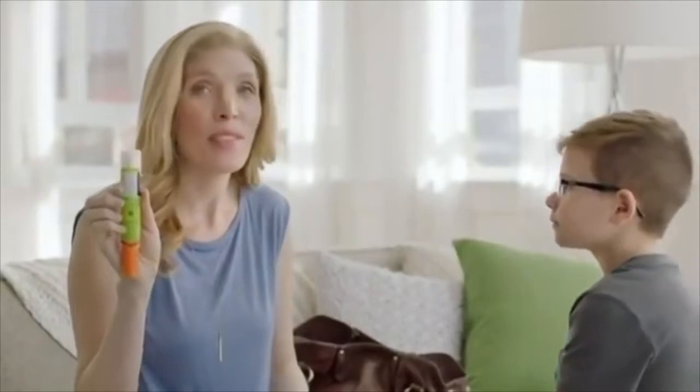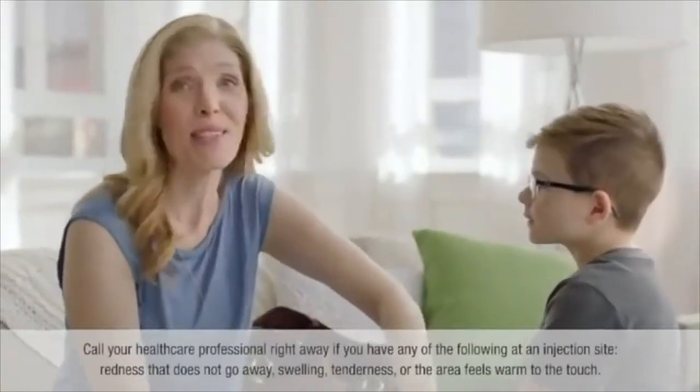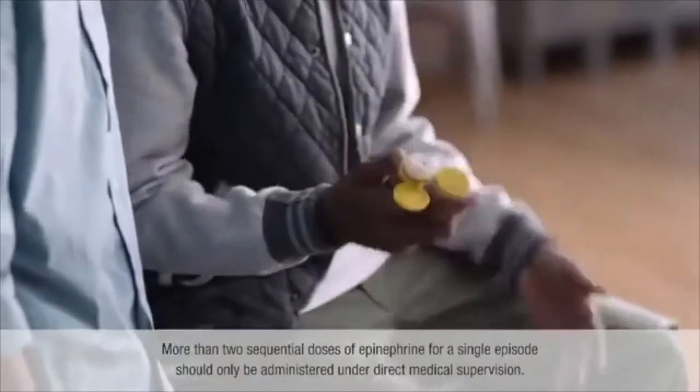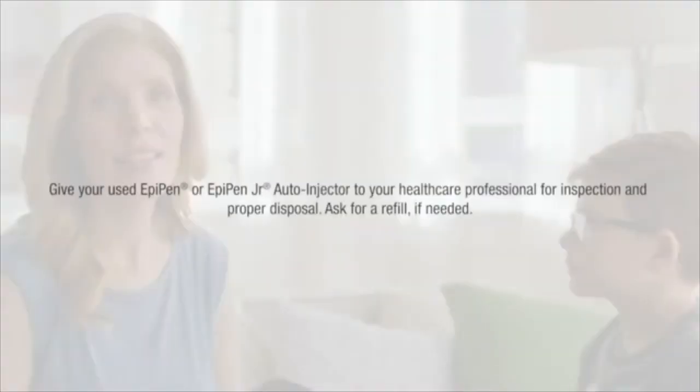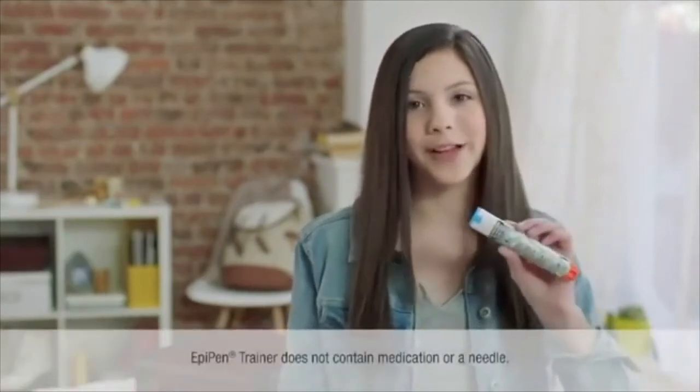The EpiPen has a special feature — the never-see needle — so the needle is totally covered up after use. Then rub the spot for ten seconds while you or someone else gets emergency medical help right away. Call an ambulance or have someone take you to the emergency room immediately. You should always carry two EpiPen auto-injectors wherever you go, because some people might need the second dose. Epinephrine is the only first-line treatment for anaphylaxis, not antihistamines — so trust yourself and do it. Don't hesitate, and practice with the trainer that comes in the box.